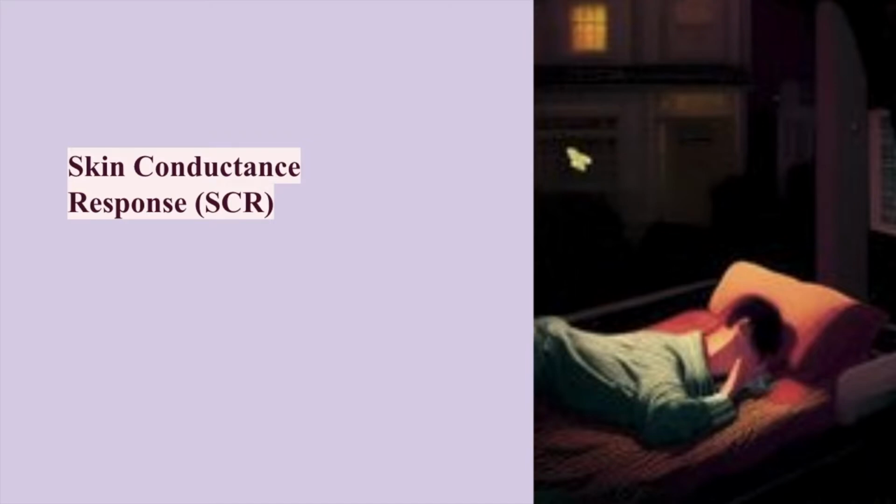In general, a higher number of SCR per minute is an indicator for higher stress. Whether that means good or bad stress, I haven't tested that out yet, so we can see if it's only specific for the type of stress. I don't think it can discern between whether you're excited because of a stressful stimuli or a negative stimuli. I think by stress, they just mean excitability. So this is just giving us an average of that excitability.